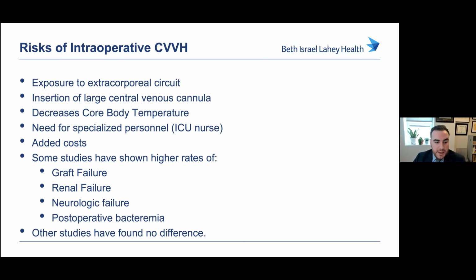But a lot of these detractors from renal replacement therapy like to talk about another thing that wasn't on this slide, which was increased risk of bleeding from renal replacement therapy.